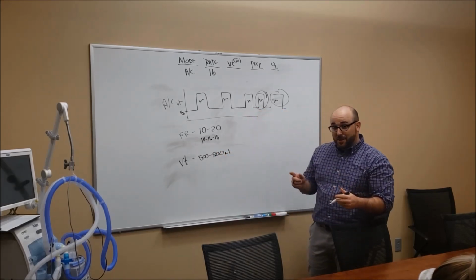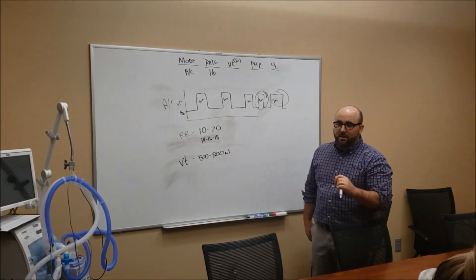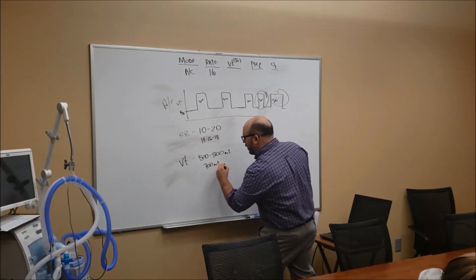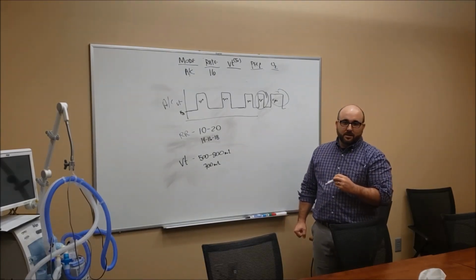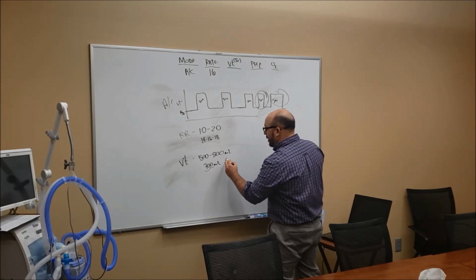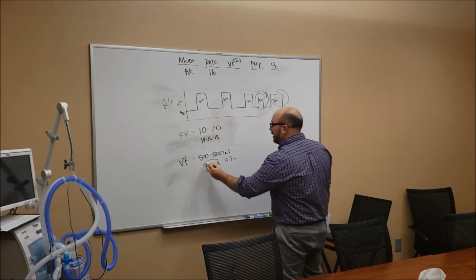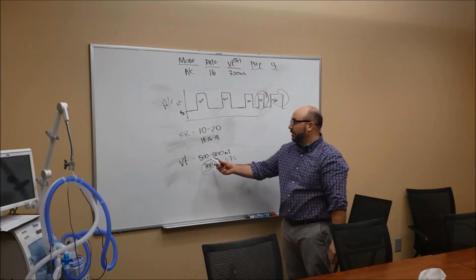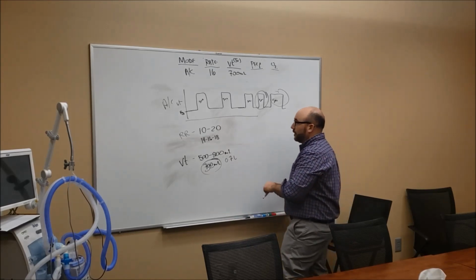Now on our ventilator though, it's going to convert that to liters. So you're going to look at this and let's say if they're on a 700 milliliter tidal volume, how many liters is that? You're at 0.7. Yeah, so it just moves it over. So it might be 0.7 liters. A little funky looking, you're like, what's going on, 0.7? It's really 700 milliliters. So then you would say 700. So the way it works is really small lady here, really tall guy right here. That's kind of where we go. So you'll see it sitting there anywhere.